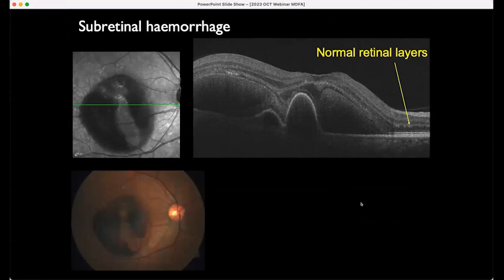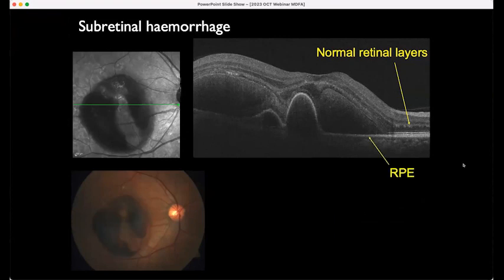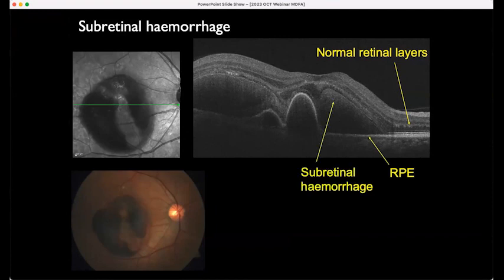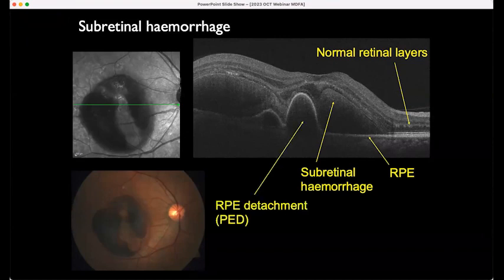This is a nice example showing various pathologies of different layers. This patient has polypoidal disease — you can see the very peaked PED here, which is typical of polyps. You can tell that this part is subretinal hemorrhage rather than sub-RPE hemorrhage because it's above the RPE. There's also a PED here and more subretinal hemorrhage over there with a smaller PED.